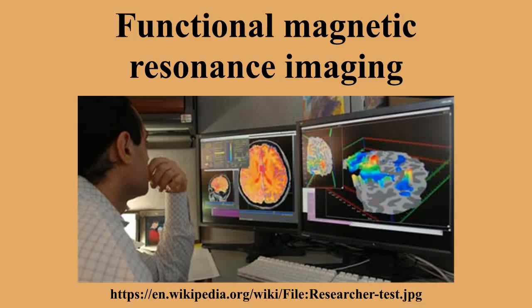Seiji Ogawa at UT and AT&T Bell Labs recognized that this could be used to augment MRI, which could study just the static structure of the brain, since the differing magnetic properties of dHb and Hb caused by blood flow to activated brain regions would cause measurable changes in the MRI signal. BOLD is the MRI contrast of dHb, discovered in 1990 by Ogawa.